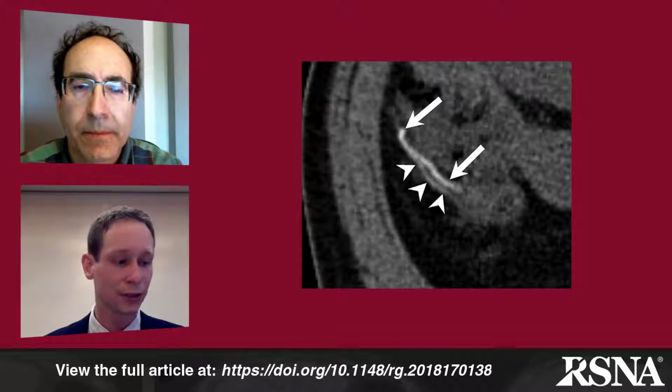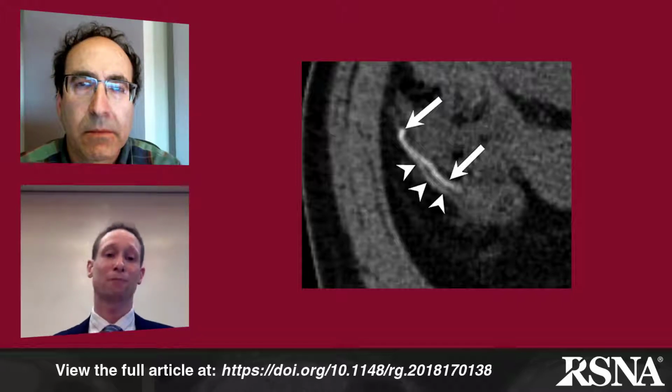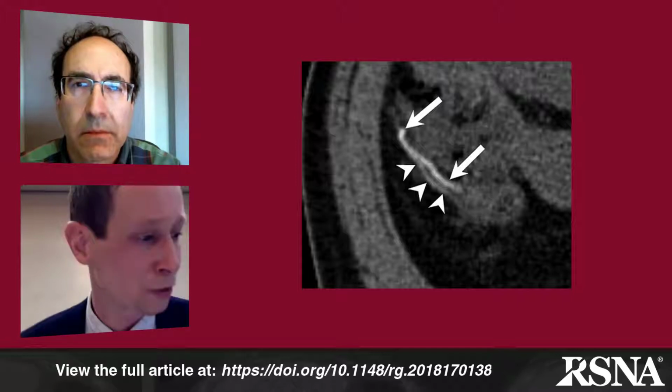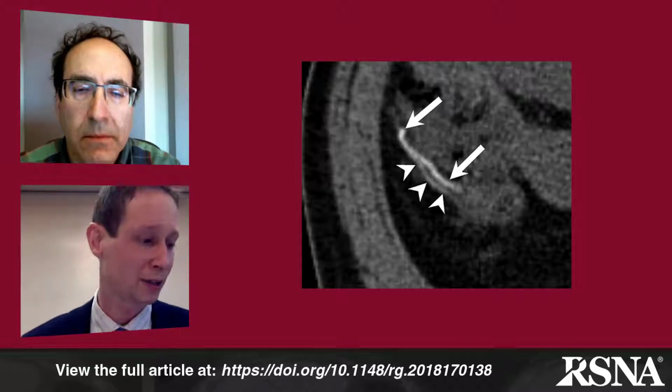In this case, this is a 58-year-old male. He presented with hematochezia. He did undergo a colonoscopy, which only found a few polyps in the colon. And they actually ordered the CT with suspicion that he had a small bowel lesion. And here, as you can see in the figure, we've got a vascular abnormality in the cecum.